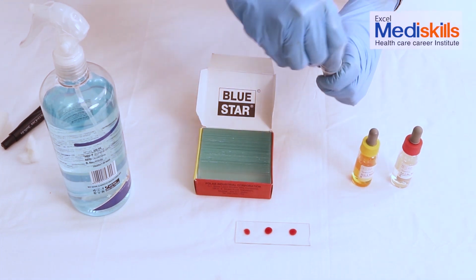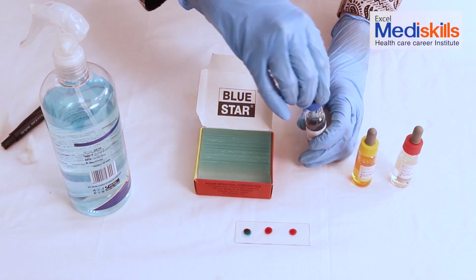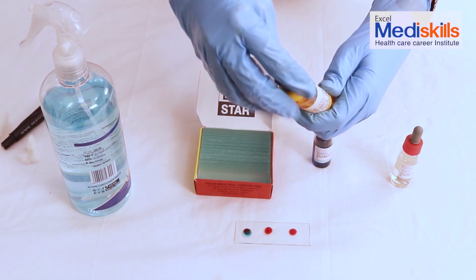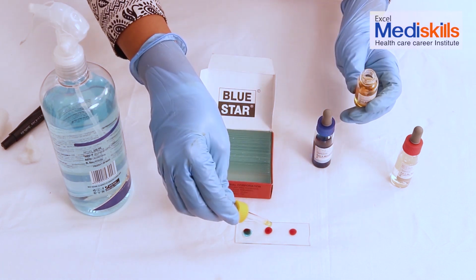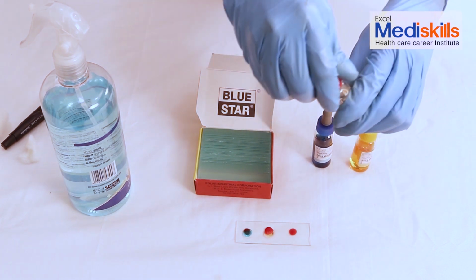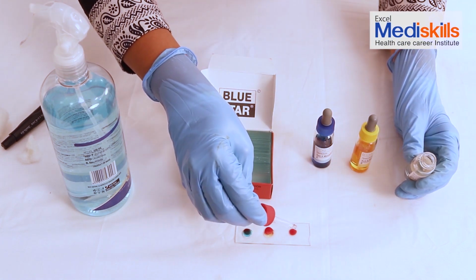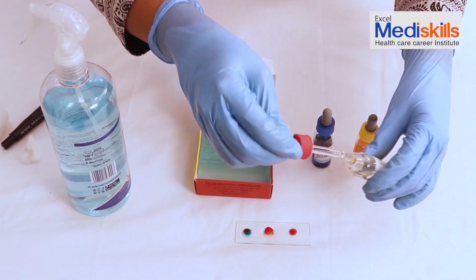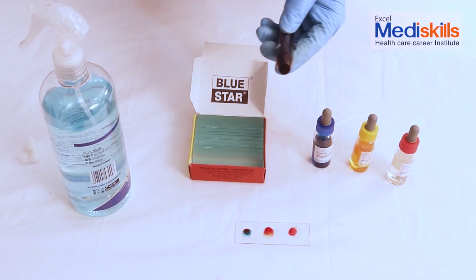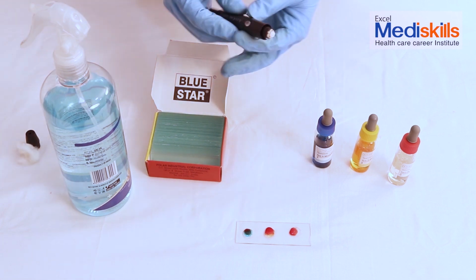Next, in the first blood drop, with this dropper, we give solution A. For the second drop, we put solution B. The last blood drop that is here, we give antibody D or solution D in that drop. The needle which we use to prick, we now use the same needle to mix this.